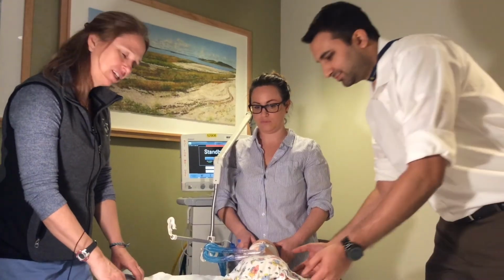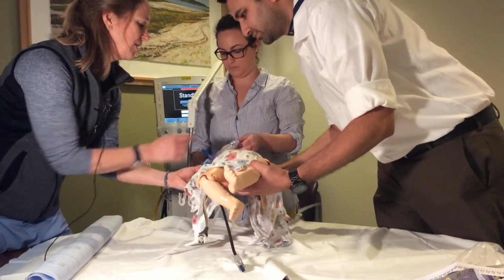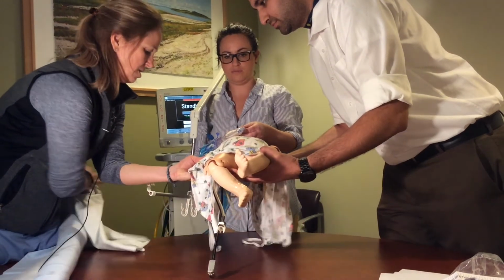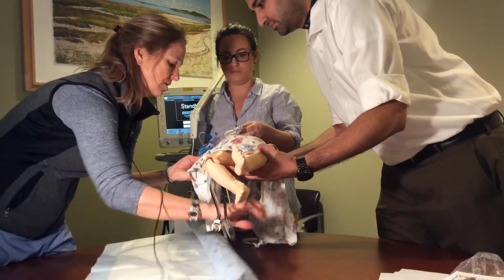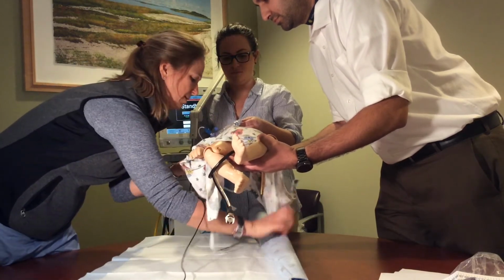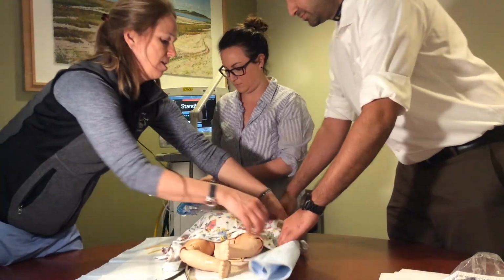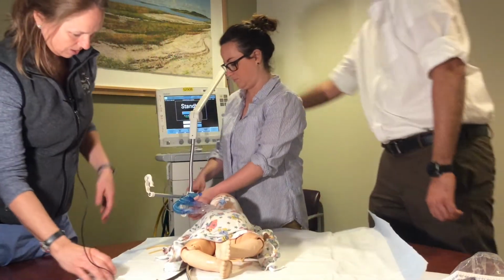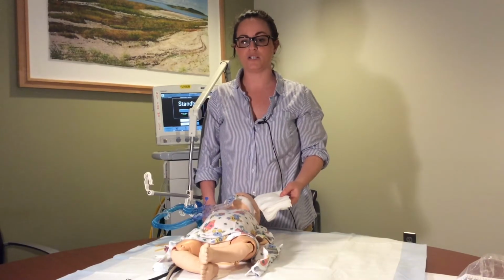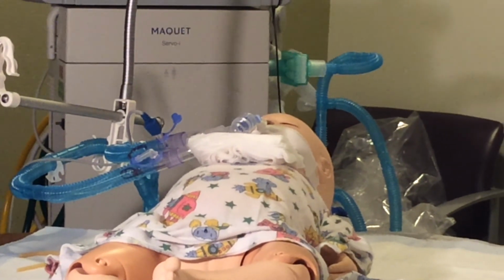Another way to change the linen on an infant is to provide support and completely lift the child while someone is stabilizing the ET tube. Pull the linen out from underneath, put fresh linen under, and then gently put the baby back down, ensuring the stability of the tube the entire time. In order to make sure there's not too much tension on the tubing, sometimes we put some gauze or some padding underneath the end of the tube.